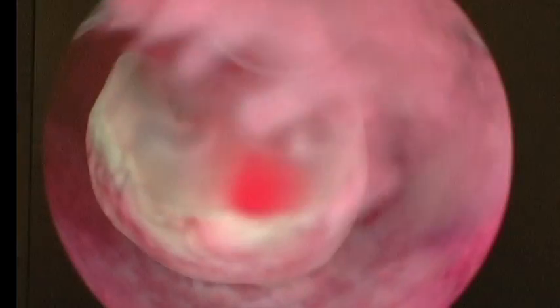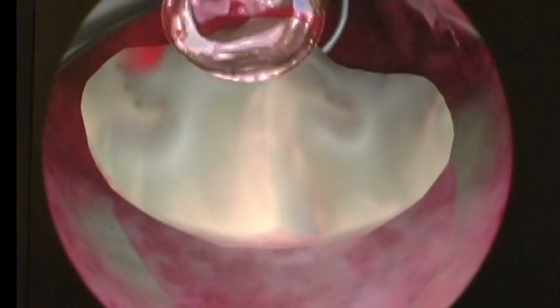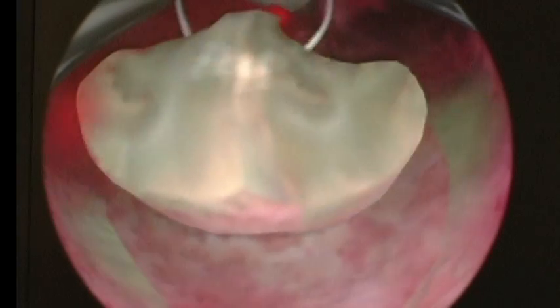I think this is a very valuable tool for residents to learn. It gives you the bubbles that you normally have when you do your procedures, just like you normally see them.